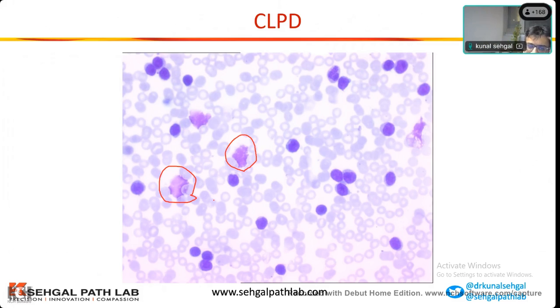Okay, sir. And CLL is diagnosed based on what? By which method will you diagnose CLL? Why is it not follicular lymphoma, mantle cell lymphoma, or marginal zone lymphoma? How do we differentiate? Which test is used? Flow cytometry. So we didn't do flow, so how did we say CLL? We can say there is an absolute lymphocytosis. Yes, sir, it is more than 5,000. And if it is persistent, we should advise flow.